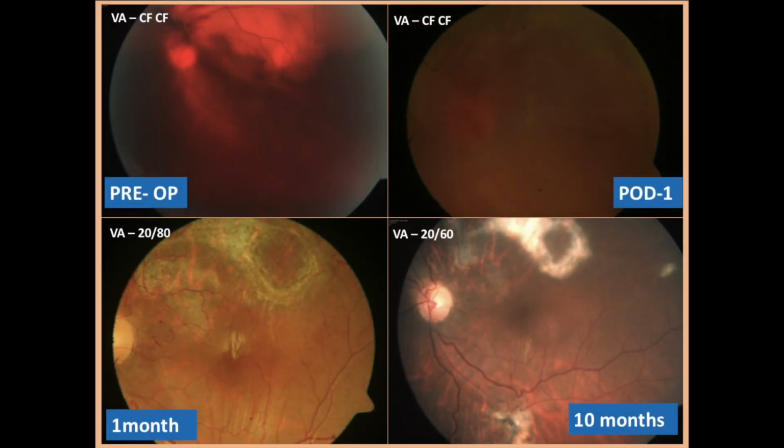With our technique, the patient gained visual acuity of 20/80 after 1 month of surgery and 20/60 after silicone oil removal. In our technique, we could immediately aspirate the blood from a small retinotomy site, and this was achieved due to clot liquefaction subsequent to the high dose of subretinal TPA injection compared to the conventional limited dose of 10 to 25 microgram.